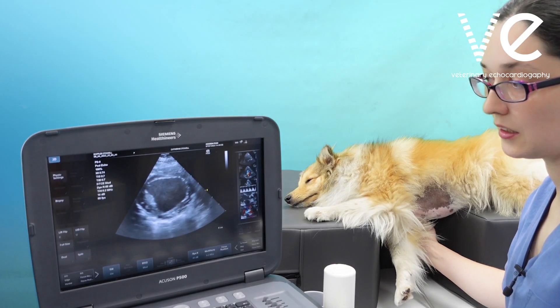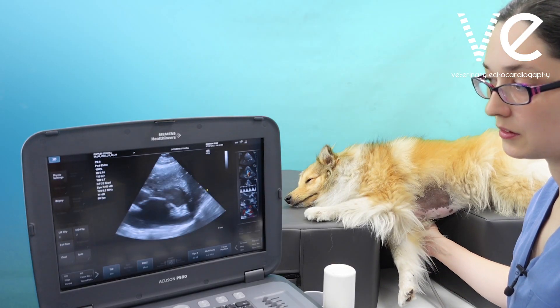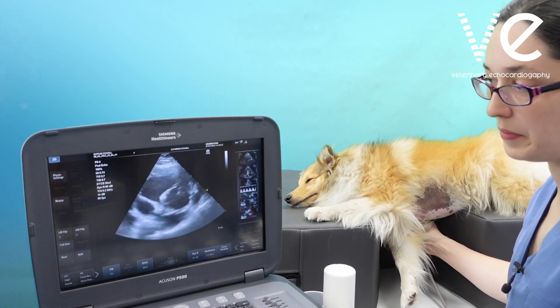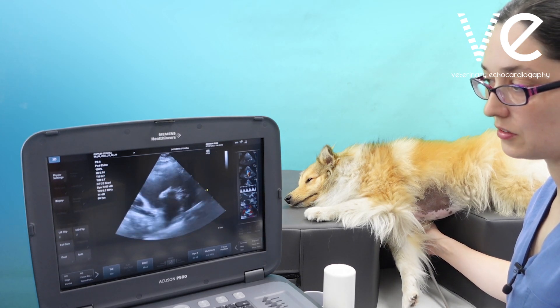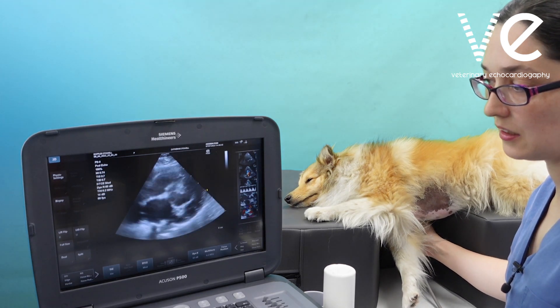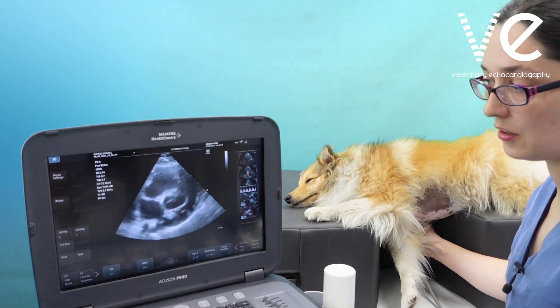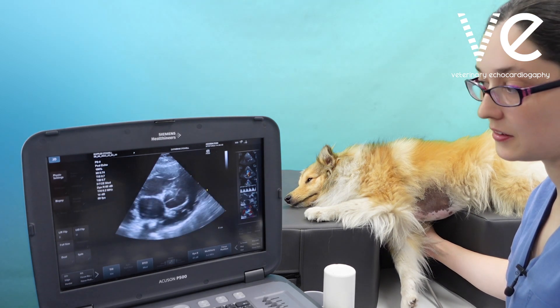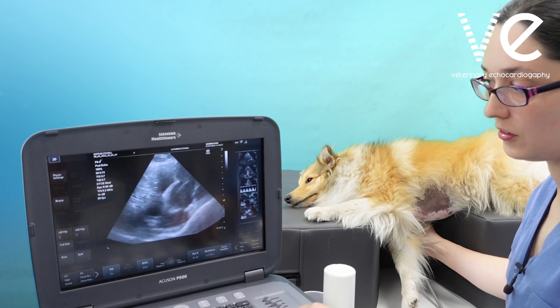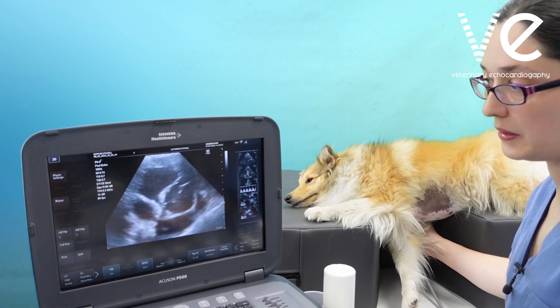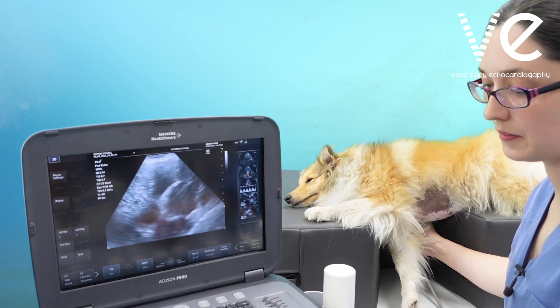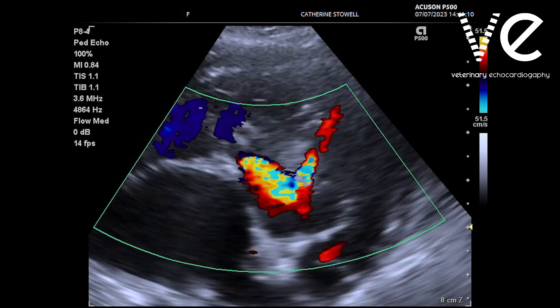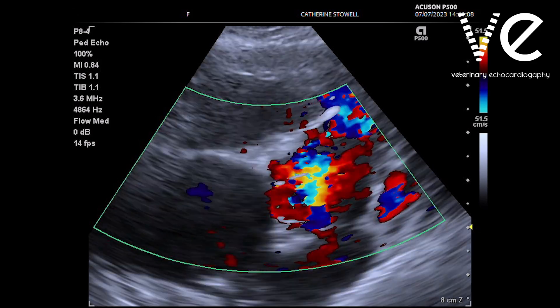Turning now to the short axis view. At the base of the heart, if you're able to visualize the aortic cusps, you want to confirm that there are three present. Zoom in over the valve and you can turn on your colour Doppler here as well.